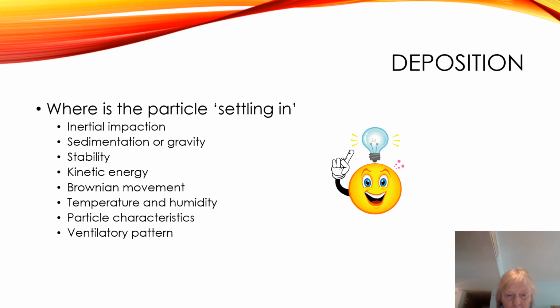If you remember, people will tell you, the doctors, pharmacists, and everything, do not store your medication in the bathroom. It's affected by the humidity in the bathroom at that point. And then the particle characteristics, we're going to talk about those again. Size is important. What size are these particles and where do they need to be? Ventilatory pattern is how are we going to teach these patients to breathe when they're taking their medications. We have different ways of teaching them for the various devices that we use.